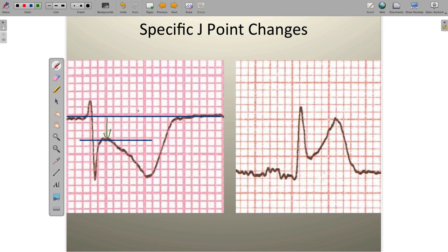Let's look at the other option. We'll establish our isoelectric line again and locate where the J point level is. In this particular case, we'll see that the J point is elevated compared to the isoelectric line. This is the second option that can occur during ischemic change — the J point can depart from isoelectric and rise above the isoelectric line. We colloquially refer to this as ST segment elevation, but the better way to describe it is J point elevation. So the two changes are J point depression, or ST segment depression, and J point elevation, or ST segment elevation. Both can occur during myocardial ischemia.